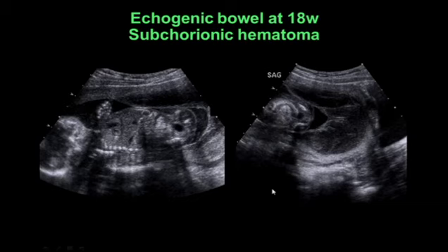This fetus also has echogenic bowel at 18 weeks. You can see this clump of bowel is quite bright, similar to the echogenicity of bone, and this was due to a subchorionic hematoma, and the fetus had swallowed some of the blood that has creeped into the amniotic fluid. You can see that large subchorionic hematoma extending down across the cervix.